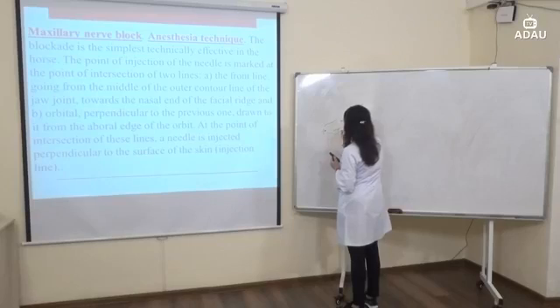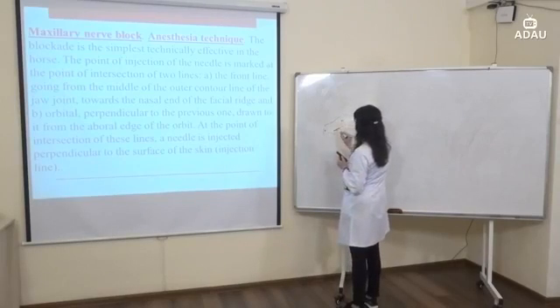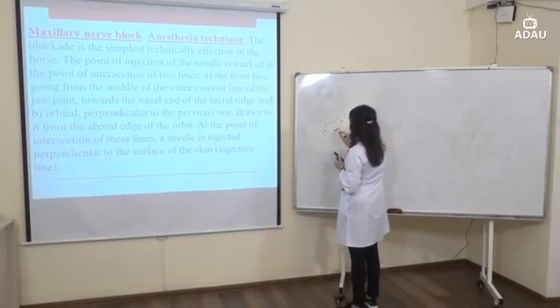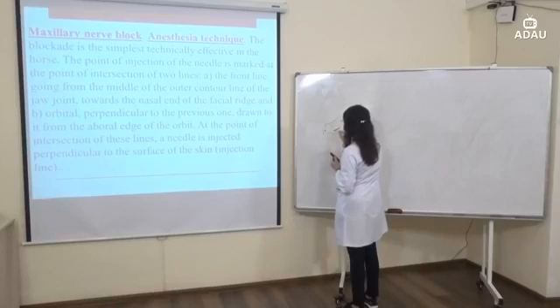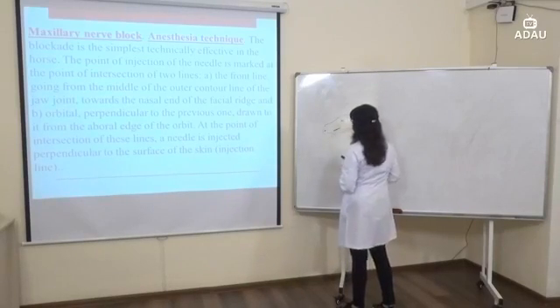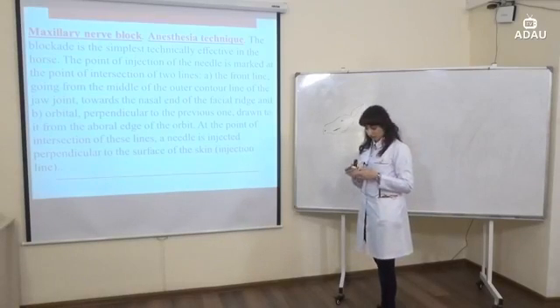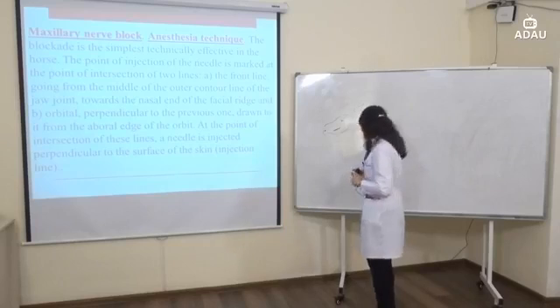Here we can see the interval between the intersection of two lines. In the middle point of this interval are located the nerves which we should inject. Inject 5 ml of 3% novocaine solution.